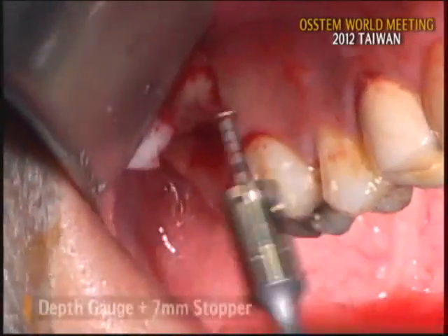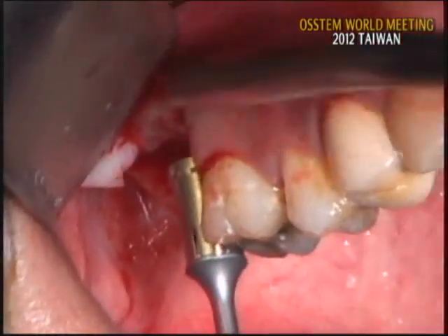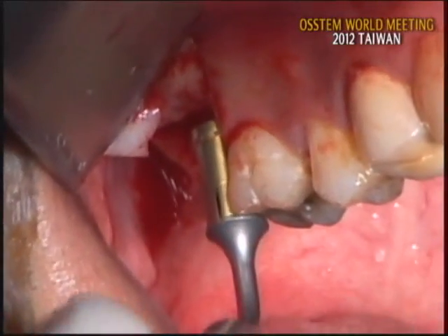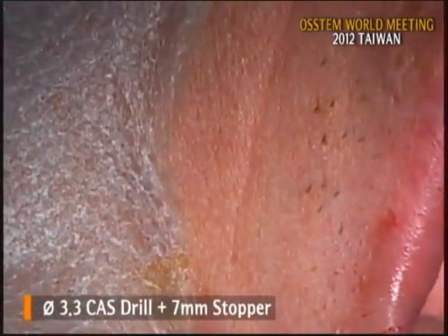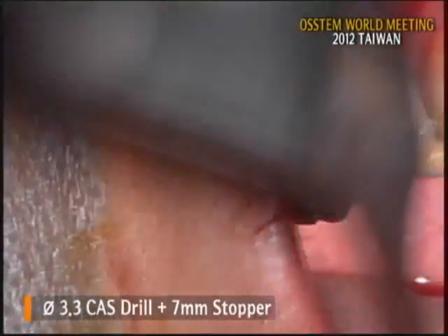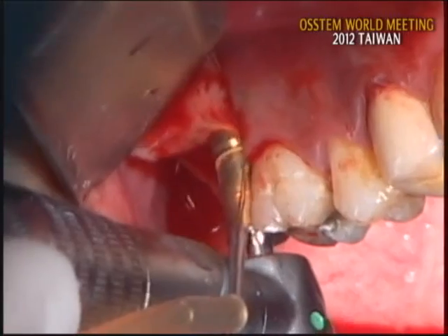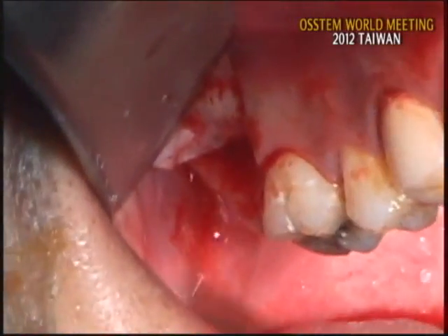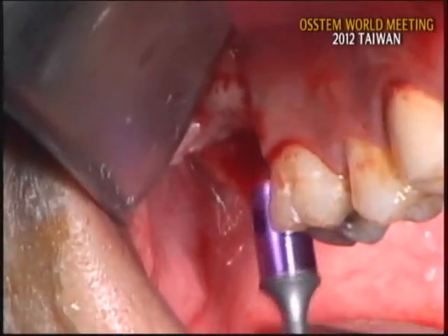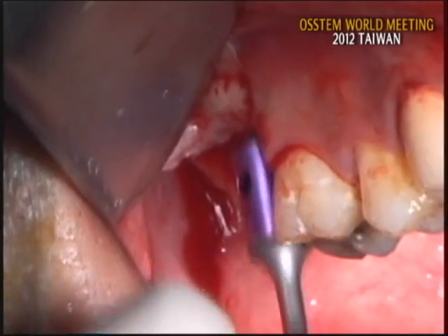Let's check with the 7 millimeter stopper. I think it's almost, but not perfectly passed. So I will use the 7 millimeter stopper, the same 3.3 CAS drill. Let's check. Okay, it is passed.